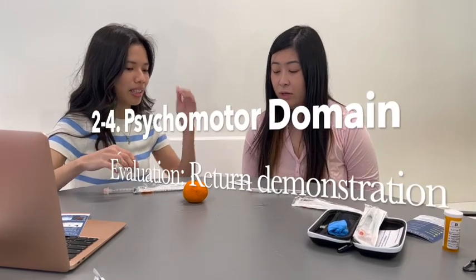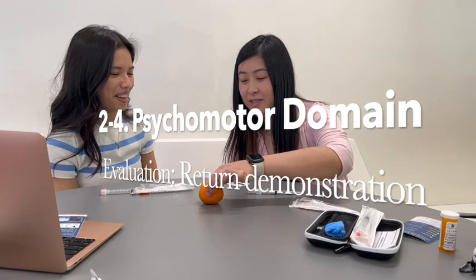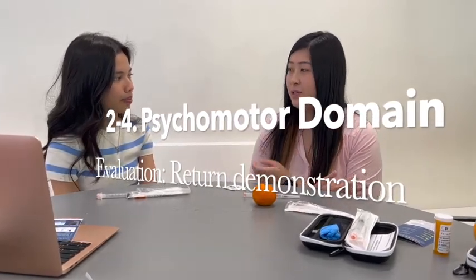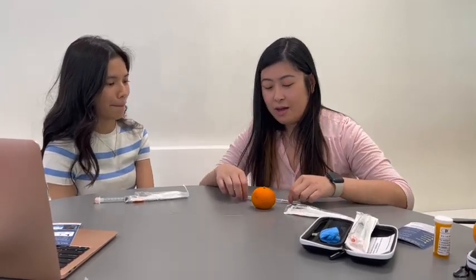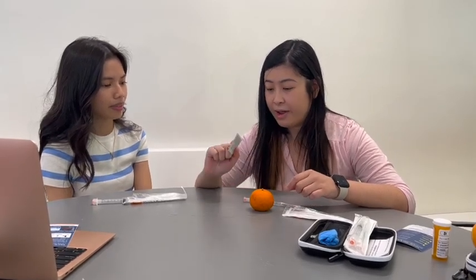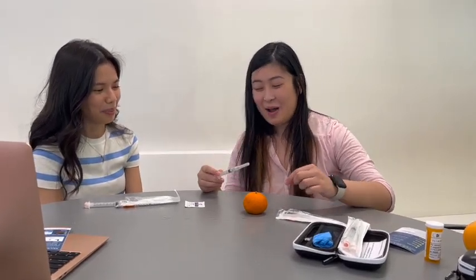So now I'll let you demonstrate what I did. Okay. And then if you get confused in the middle, I could just also walk you through it. Okay, sounds good. So you said the sites to inject them is usually your large muscles, so your arms or your thighs, and then your outer buttocks. So then we can use an alcohol swab to cleanse the area. However, in an emergency situation, we don't have time for that, so we're gonna skip that.